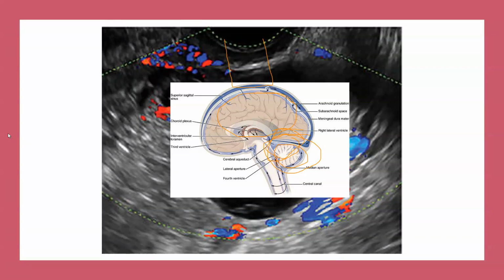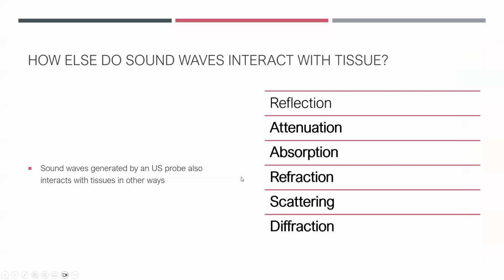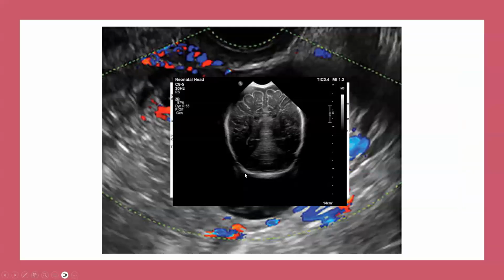Any questions? These are just examples, again, of our interaction. This is what the brain basically looks like. And as I mentioned to you, this is the fontanelle. This is the incident probe. You can see the lining over here. Technically, this would be one meningeal layer, extraaxial space.